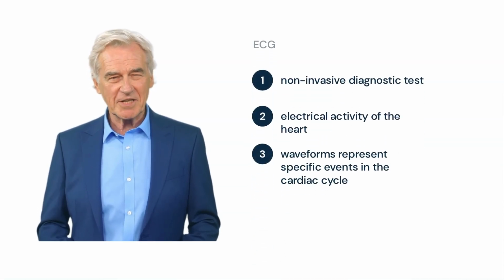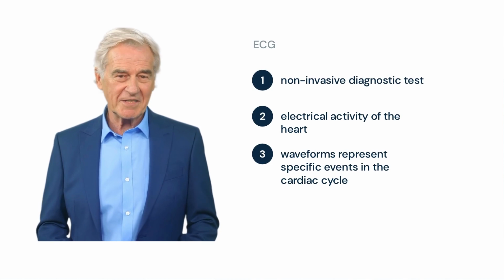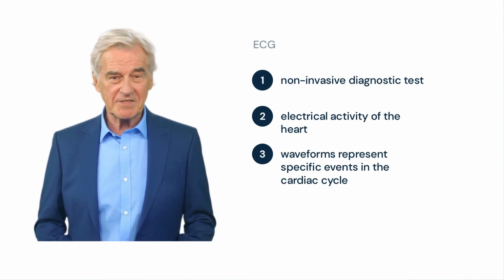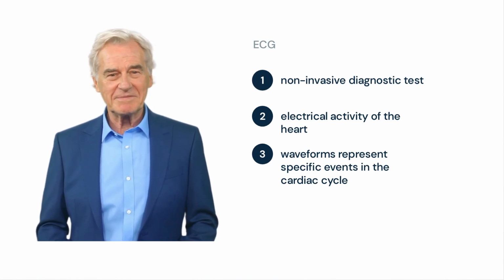First, let's briefly review what an ECG is. An ECG is a non-invasive diagnostic test that measures the electrical activity of the heart. It records this activity as a series of waveforms, which correspond to specific events in the cardiac cycle.